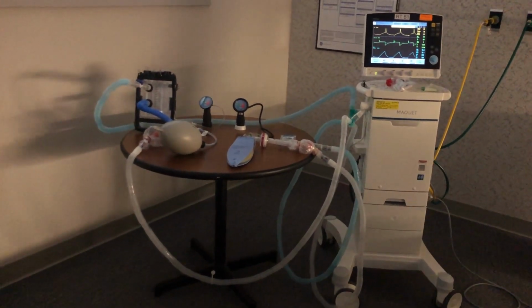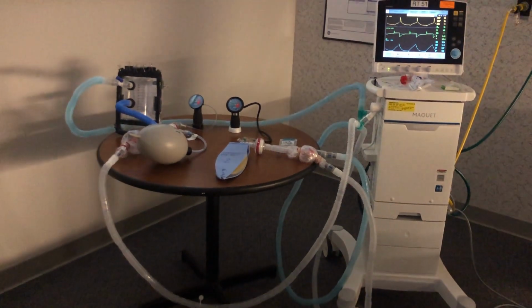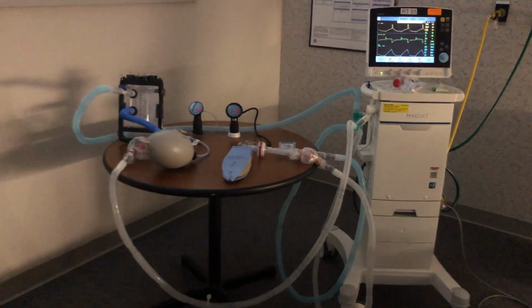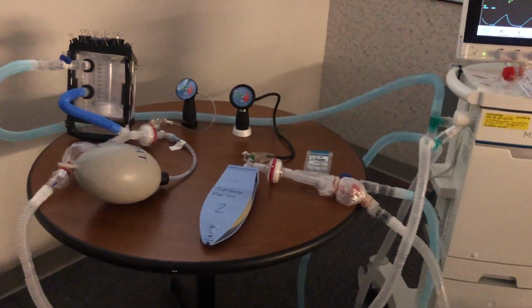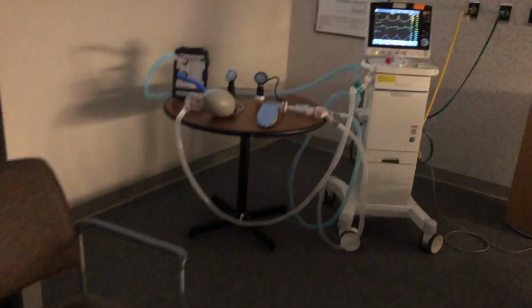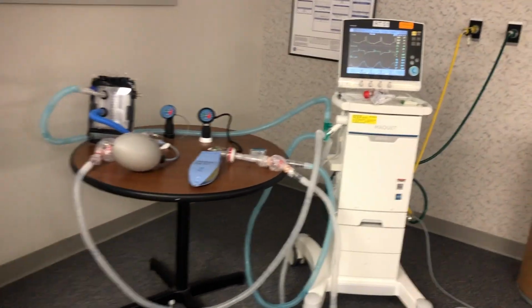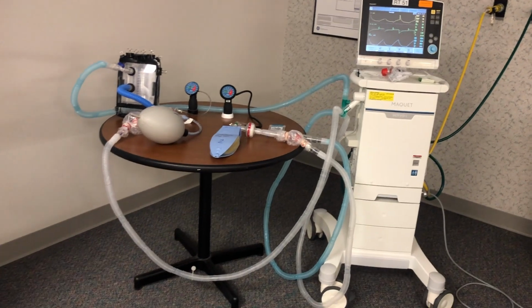The ventilator can go up to a tidal volume of 4,000. So theoretically you can combine around 8 patients, but I would suggest probably we do 4 or 5 at the most. And with this setup, this is a disaster setup, and we should be able to ventilate patients who are otherwise not going to survive because of lack of ventilators.